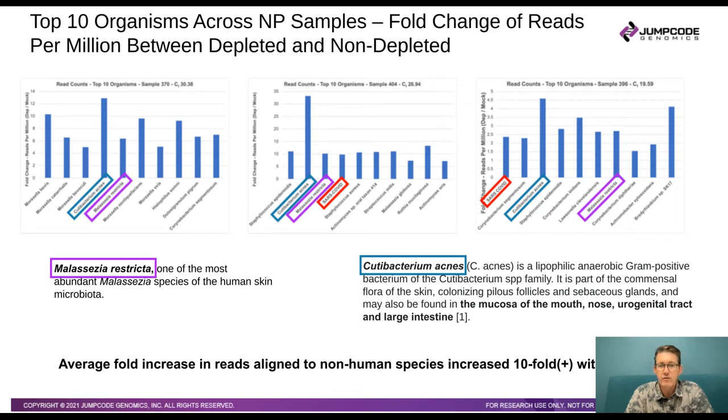And we're seeing somewhere between a 2.5 and 3-fold increase in reads per million to the COVID genome in even the low CT, or high viral titer, sample. These are very interesting results in the sense that, using this technology in shotgun metagenomics, we have the ability to go in an unbiased and hypothesis-neutral way and start to look at what the compositions of these samples are, while also being able to obtain the designation of the COVID genome.